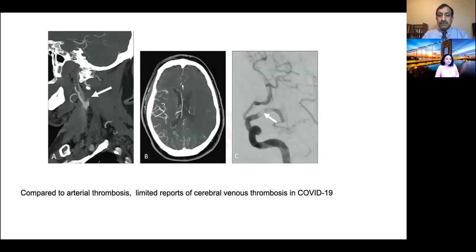This is a prototypical example. We see there is an acute cutoff of the internal carotid artery in the neck, and the CTA of the intracranial vasculature demonstrates a lack of flow in the left MCA and to a lesser extent ACA branches. On an emergent angiogram, one can see a large filling defect — a large clot burden — in this patient in the left MCA.